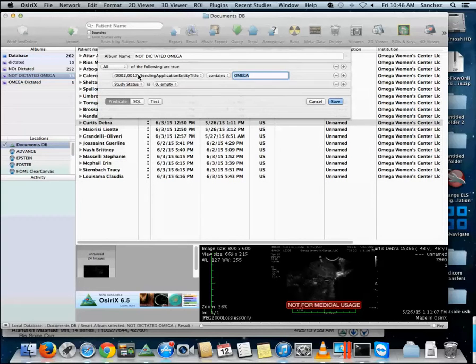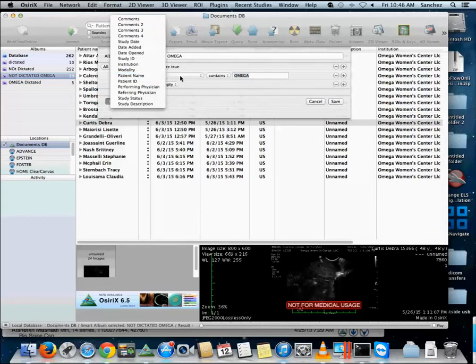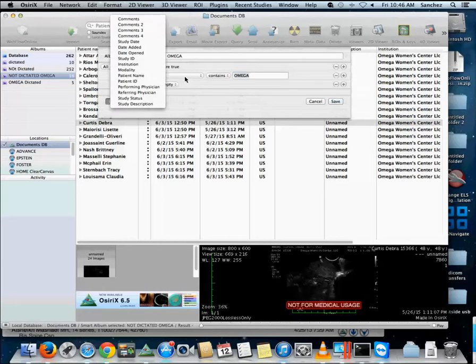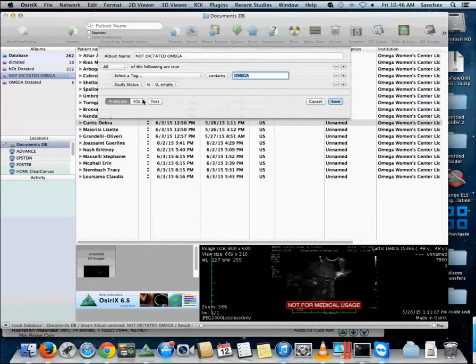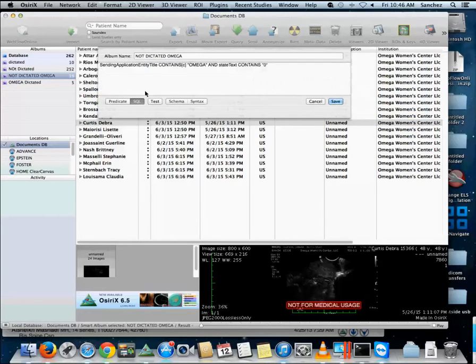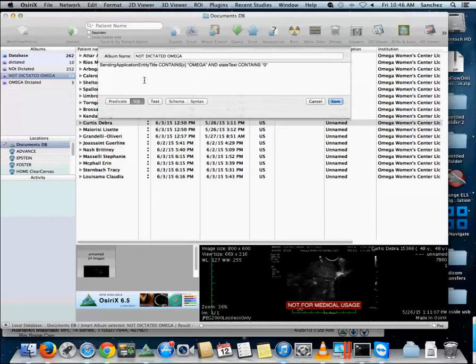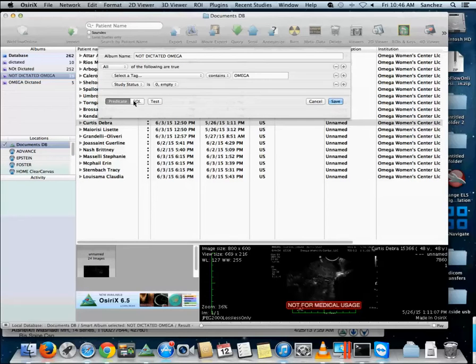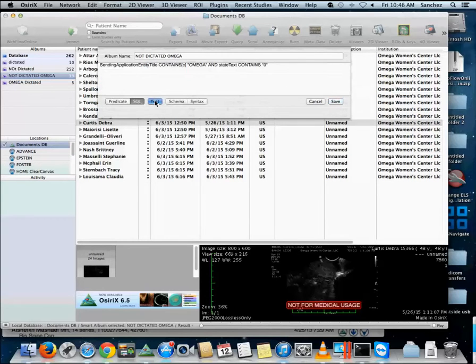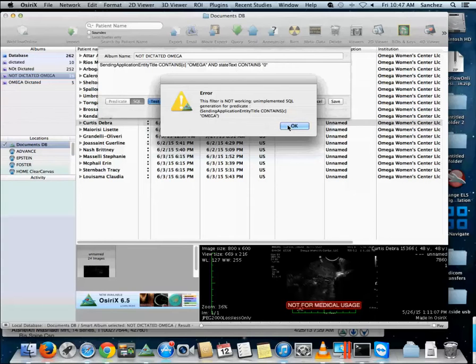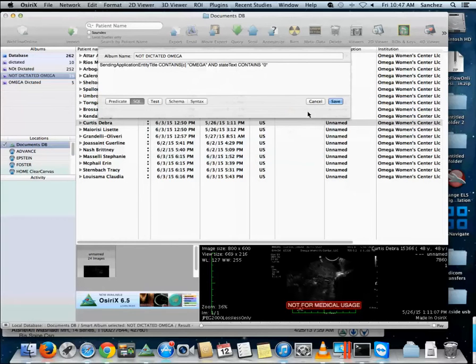It does change the tag name here that's missing. Let me go back and then go back. So it did change it, but when I do test it then gives me an error saying filter not working, unimplemented SQL generation predicate. So there will be some SQL querying that needs to be done to create these smart albums.